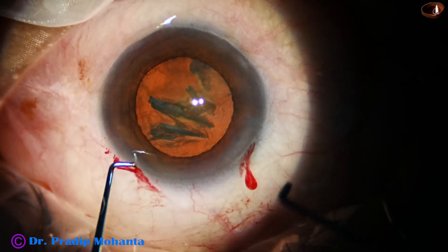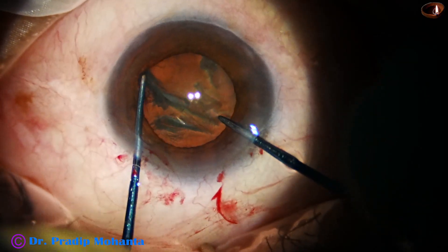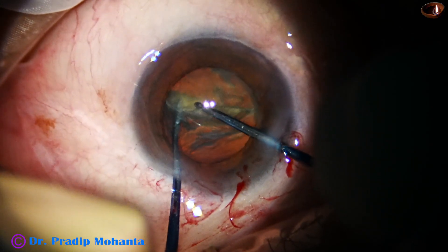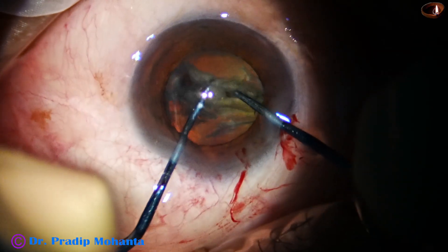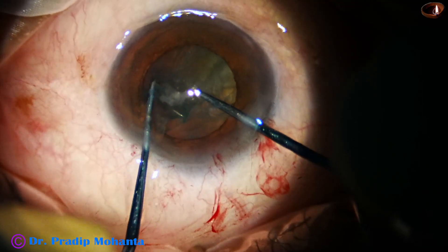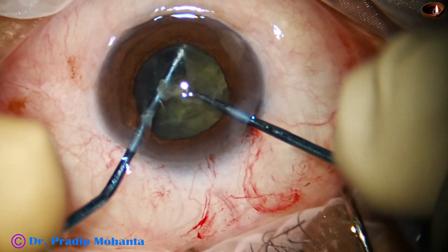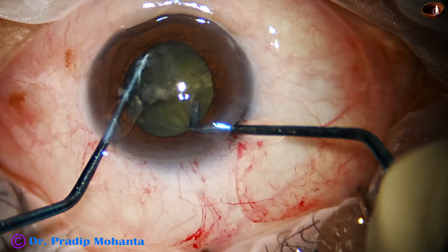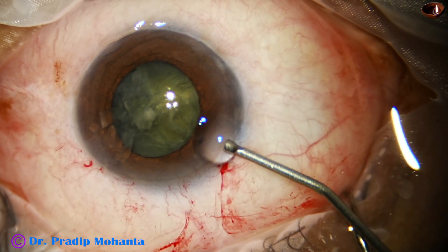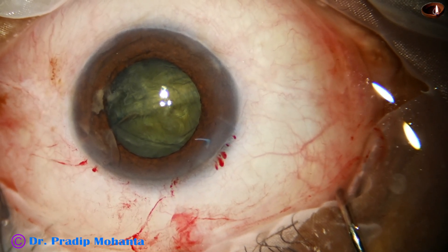Now, here goes the pre-chop — Mohanta's pre-chopper and nucleus sustainer. The pre-chopper is engaged here. The sustainer hooks the opposite equator, going just under the rhexis margin, and we get a nice crack. This is about a grade 3 nuclear sclerosis. We can see that it is a little on the harder side, but easily we can pre-chop. Yes, I have got 3 pieces — one hemi-nucleus has been divided into 2 pieces and one hemi-nucleus has not been pre-chopped, but still we can manage it easily.